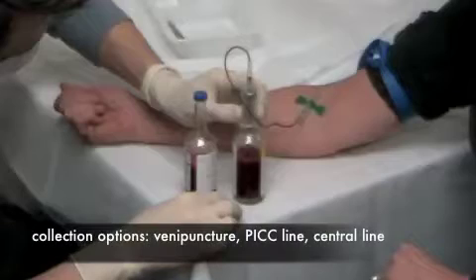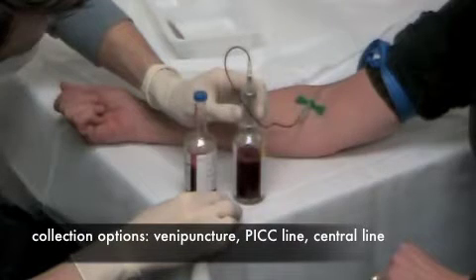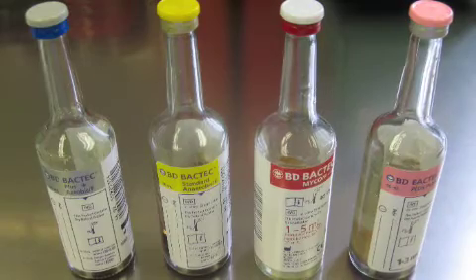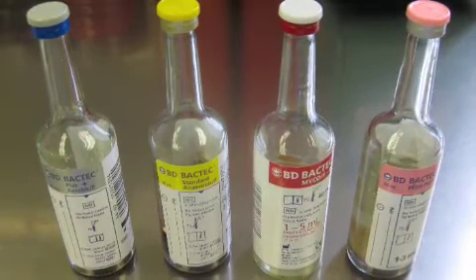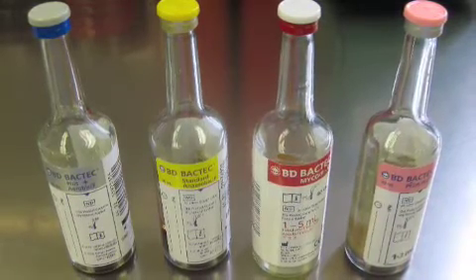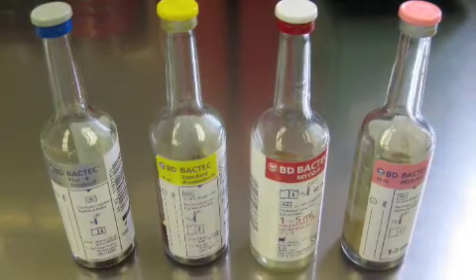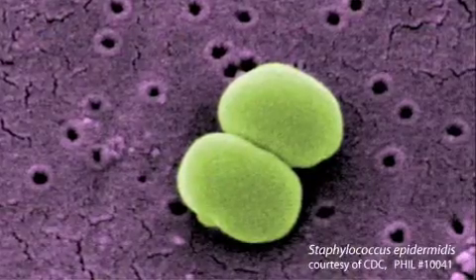Blood culture is usually performed by venipuncture, but can also be collected from indwelling lines. Aerobic and anaerobic vials are typically drawn together as a set and constitute a single culture. Smaller blood culture vials are used for children since less blood can be collected.